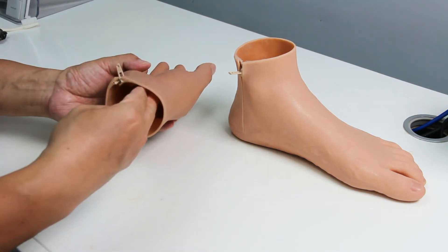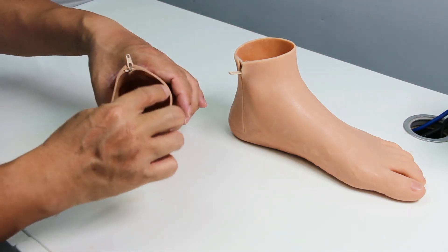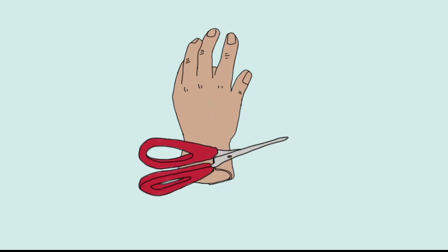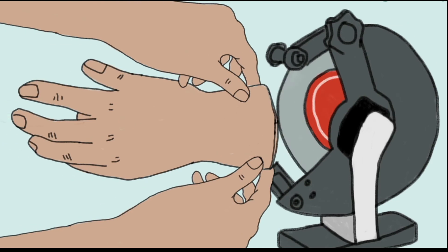If the patient does not fully open the zip and stretches the opening during donning and doffing, a split may happen. Do not ignore the split, because it will grow and break the whole prosthesis. The patient has to return the prosthesis to the clinic, where the technician can cut out the split and grind the edge so that the split will be fixed.